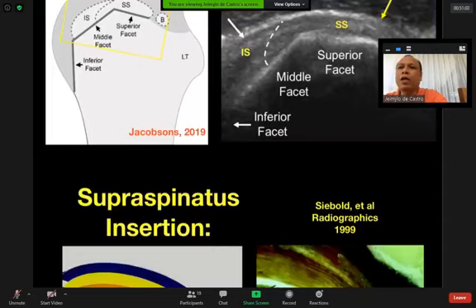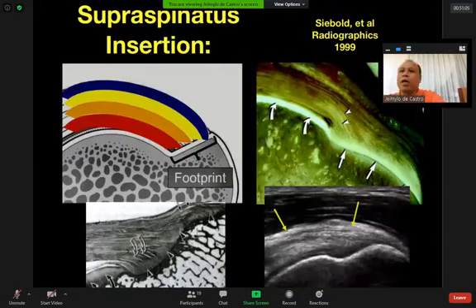So as we proceed here, this is how the supraspinatus insertion is shown. The fibers are inserted by layers up to the facet by which it inserts into the greater tuberosity. The fibers are arranged in such a way that when one layer is affected, not every layer could be damaged, because the fibers follow what you would call a pinnate arrangement of the muscle.